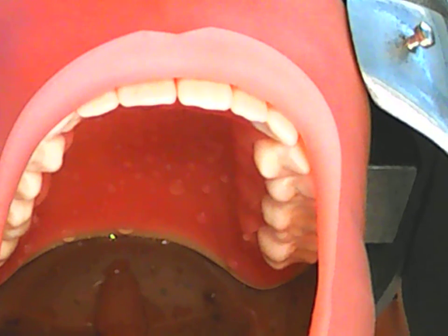The correct number of holes and correct hole positions will look something like this. We're doing 2-4 to 1-3. If we use this dental dam as a reference, I'll review the guide here. I would punch them symmetrically, and what I mean by that is when you do the 2 centrals together, it's more symmetrical.